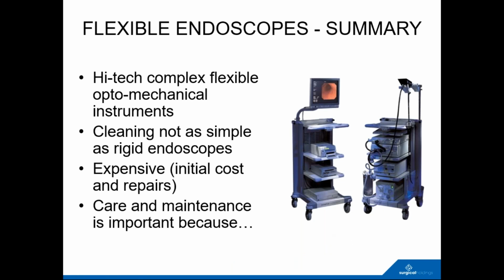So, Nick, sorry, just to interrupt. I think you've probably covered it, but there's a question from Hank Bouch from Beyond Clean, who we both know. Hank's just said, outside of infection control issues, what are the most common device failures related to flexible endoscopes?